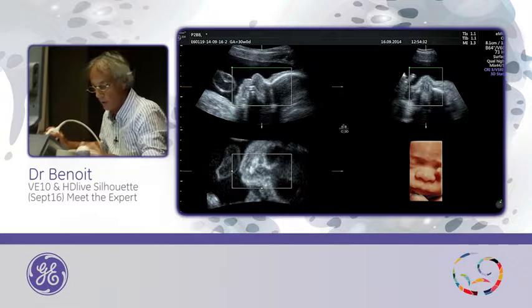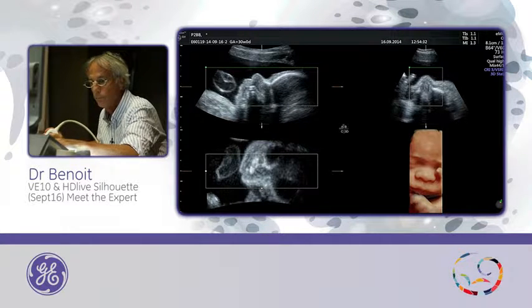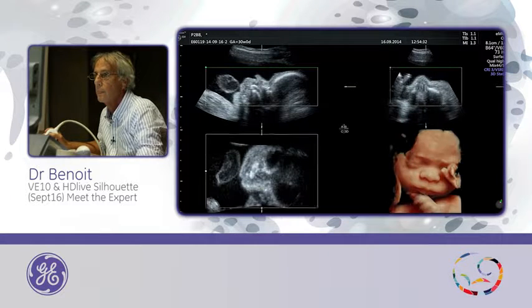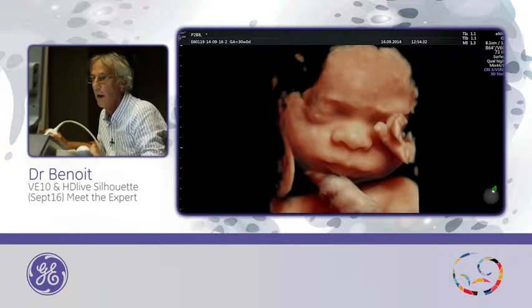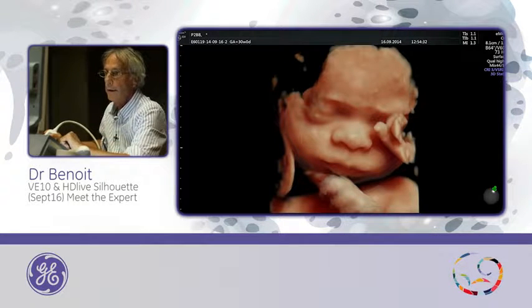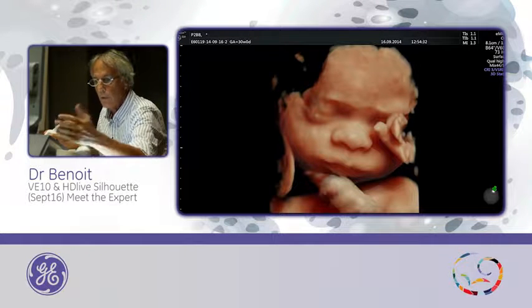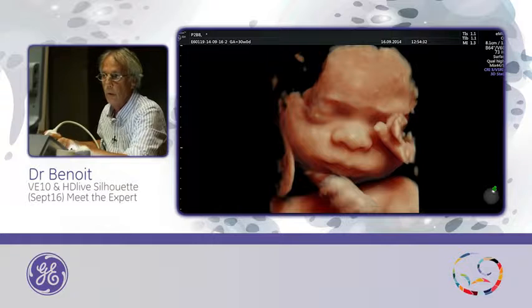Now we'll work with this picture. So increase the box on B-plane. This is a result. It's nice. I save it. And this is a HD Live, and I will see on the sub-menu, there is no silhouette on this one.